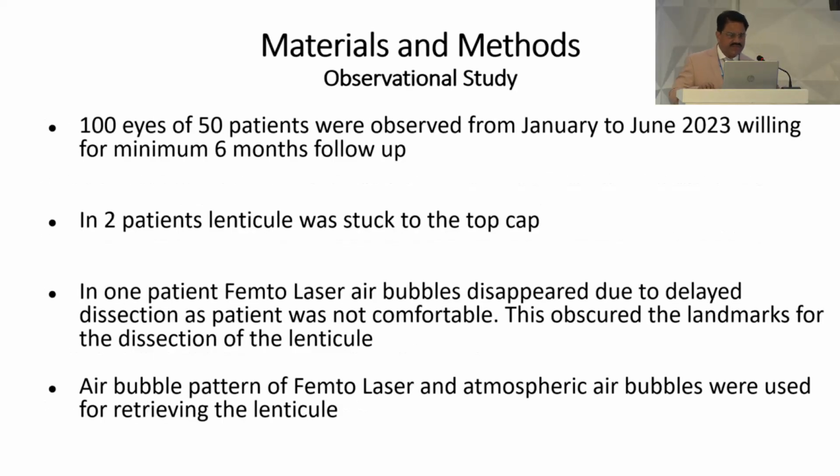100 eyes of 50 patients were observed from January to June 2023, willing for a minimum 6 months follow-up. In 2 patients, the lenticule was stuck to the top cap. In 1 patient, femtolaser air bubbles disappeared due to delayed dissection as the patient was not comfortable. This obscured the landmarks for the dissection of the lenticule. Air bubble patterns of femtolaser and atmospheric air bubbles were used for retrieving the lenticule.